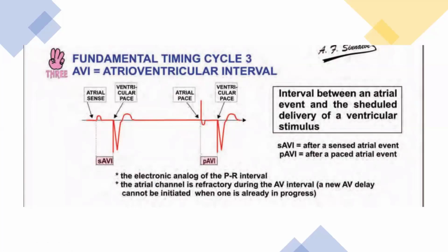So the net result is an atrial event followed by a ventricular event. If the patient has native conduction, in some cases this P wave will be conducted and followed by a QRS complex with a normal PR interval. So the net result is that every atrial event, either sensed or paced, is followed by a ventricular event, either sensed or paced.